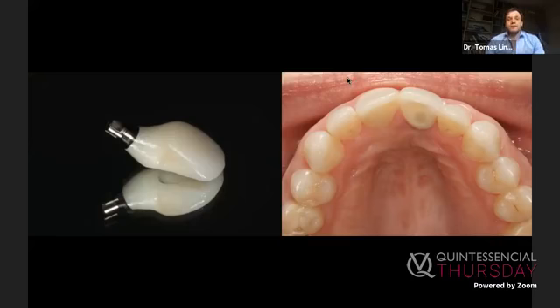But as I mentioned before, first comes a good position of the implant, which is done during the surgery. And I come to thinking, because as I said, I looked at it a little bit philosophically, that if you have a bad position of the implant, probably now it's better to remove the implant and start over.